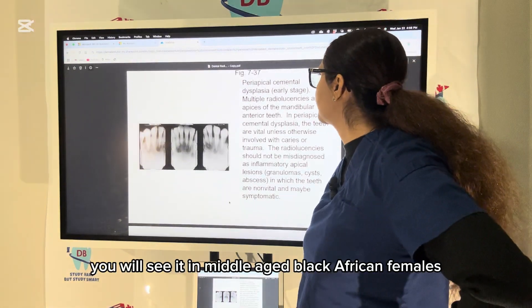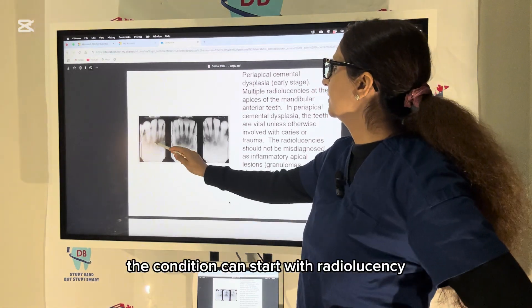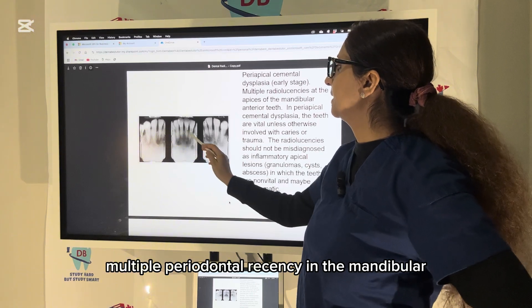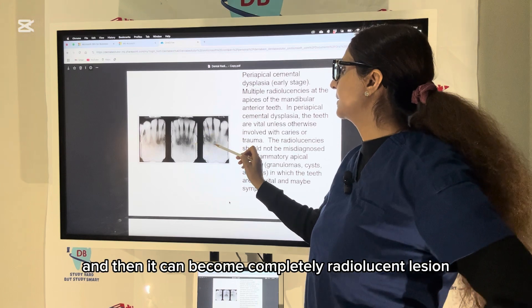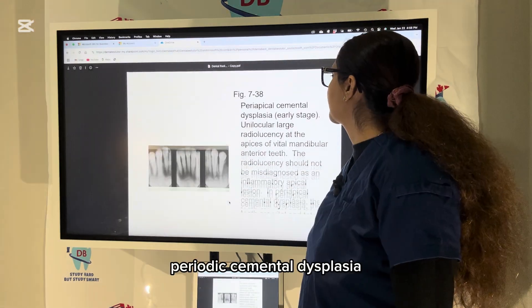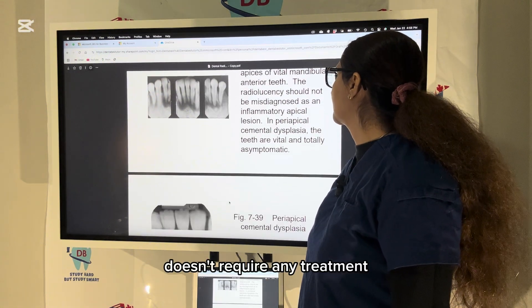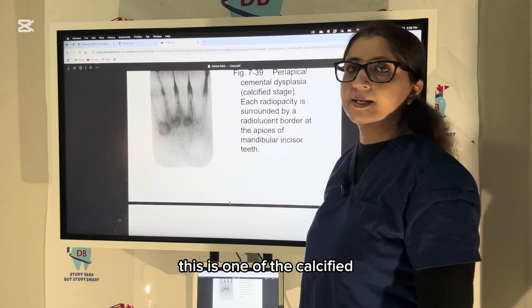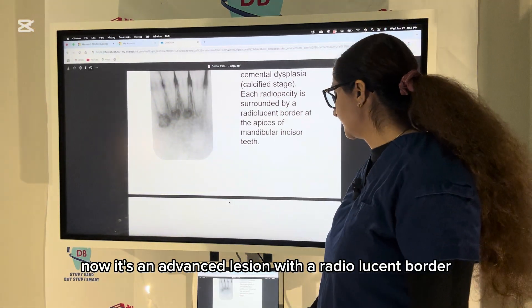Periapical cemental dysplasia is a very important condition. You will see it in middle-aged Black African females. The condition can start with radiolucency with a radiopaque border — multiple periapical radiolucencies in the mandibular anterior region. Then it comes to a mixed stage of radiolucent and radiopaque combined, and finally can become a completely radiopaque lesion with radiolucent borders. The teeth are vital; it is asymptomatic and requires no treatment — just observe. This is the calcified stage.